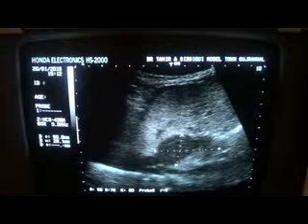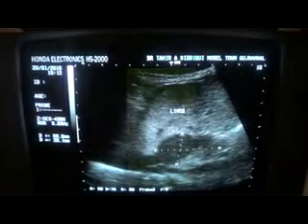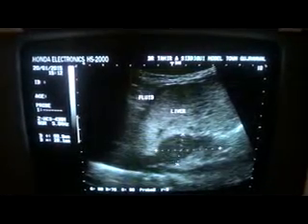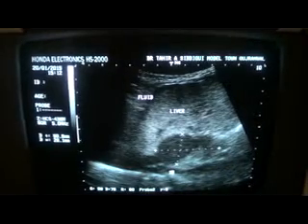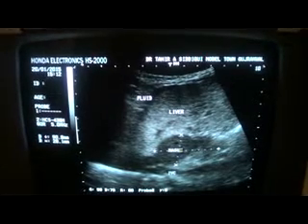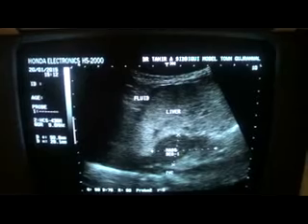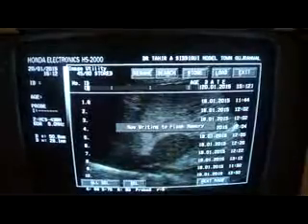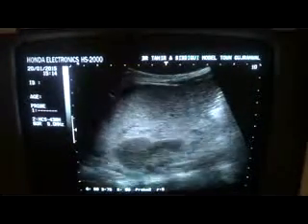It's bounded anteriorly by the ligamentum venosum, and posteriorly we can see the IVC coursing through it. And this is fluid, ascitic fluid. This is the proximal IVC coursing posterior to the caudate lobe, and this is the mass relating to segment 1, the caudate lobe of the liver. Now, had I seen the caudate lobe separately, I would have said that this can well be a lymph node, but it is not, because if this were a lymph node, then where is the caudate lobe?